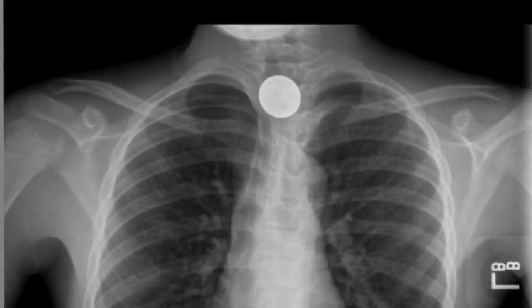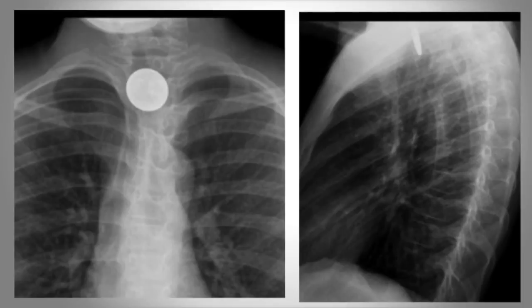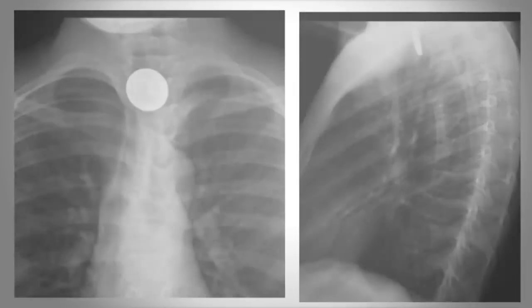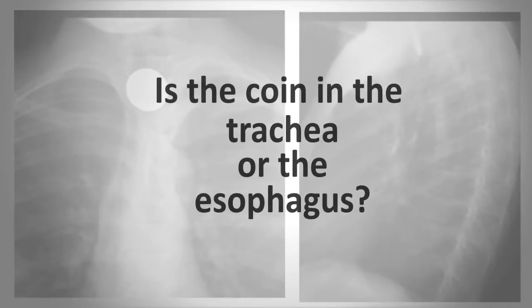Here is a chest radiograph of a young patient who has some discomfort in the neck. Shown here is what looks like a round metallic opacity. Is that metallic opacity a disk or a sphere? To determine this, we need to get another view. From this lateral view, we can now see a radiopaque line. This object, round and thin, has to be a disk — most likely a coin. From the size of it, it looks to be a quarter. But is this coin in the trachea or in the esophagus?